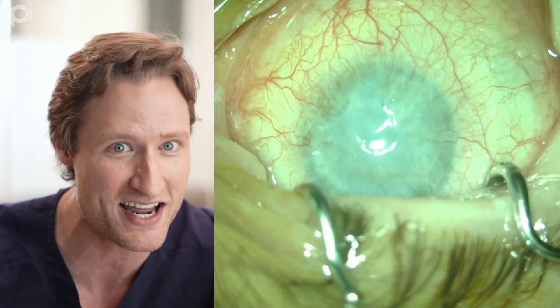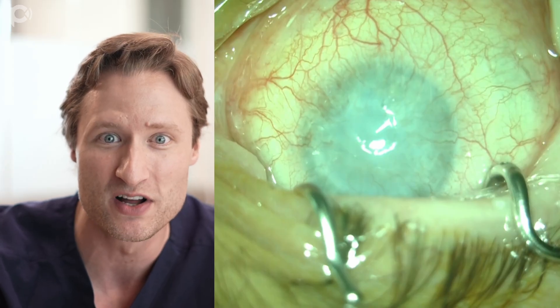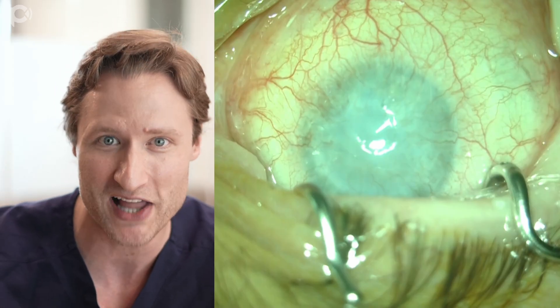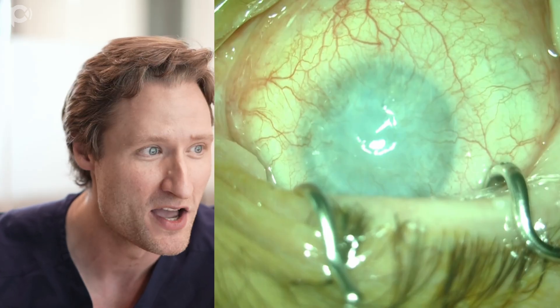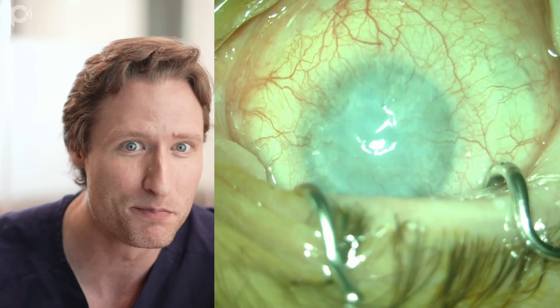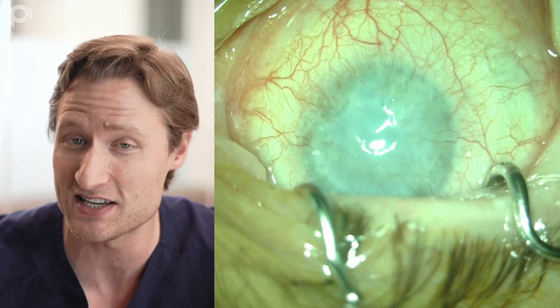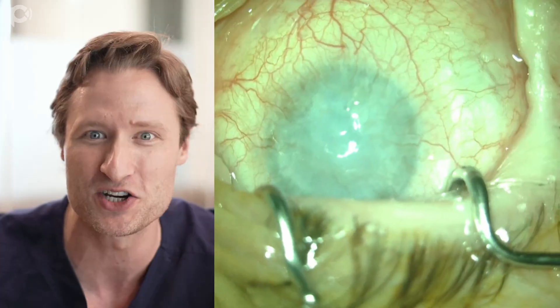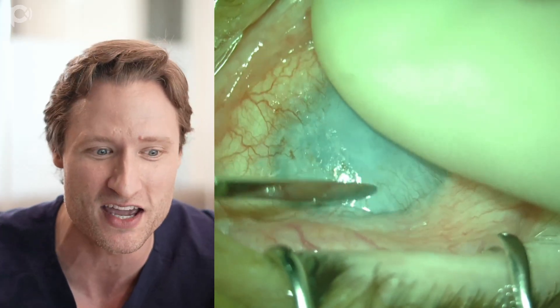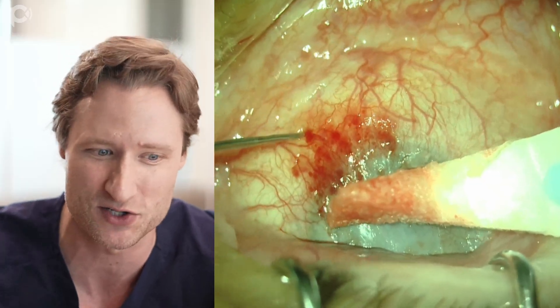The first thing is you can't see anything into the eye. Normally, if you're going to scrape the cornea, wait until the last possible second to do so because it transiently improves your visibility a lot, but then you lose back what you've gained. But here I can't see anything, so we start the operation by scraping the cornea to see whether it's even going to be possible to attempt this surgery.